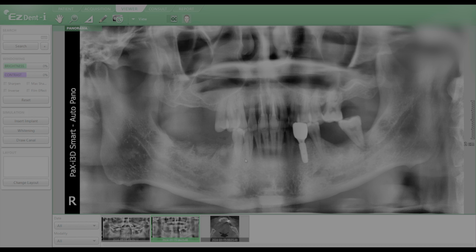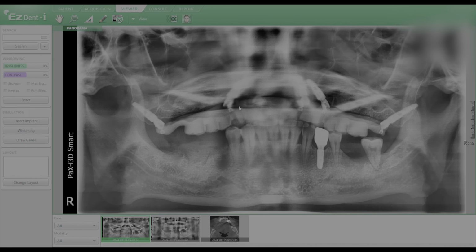With him only being 40 years old, I mean, this guy's 5 years younger than me, right? So I'm only, again, going to do on patients what I would do in my own mouth. I know this is a horrible x-ray because he was a little bit sedated. We nailed some pterygoids, we got great stability, and we did 4 other implants in front of his sinuses. I also did bilateral sinus lifts, so I'm going to place 2 more implants on him in the future.